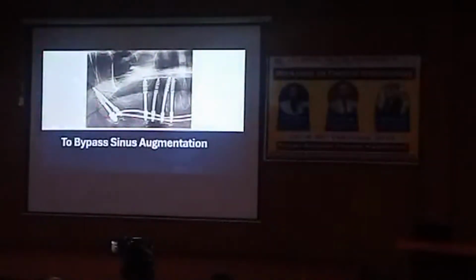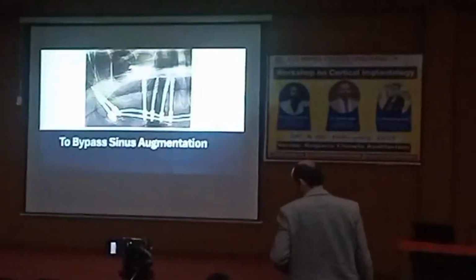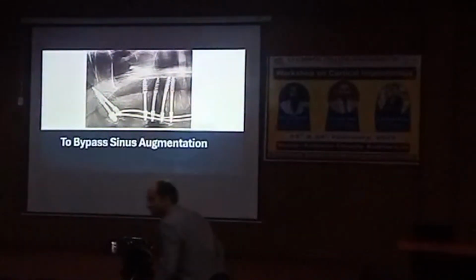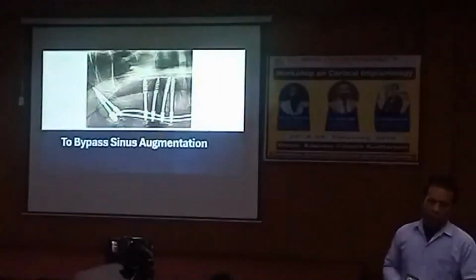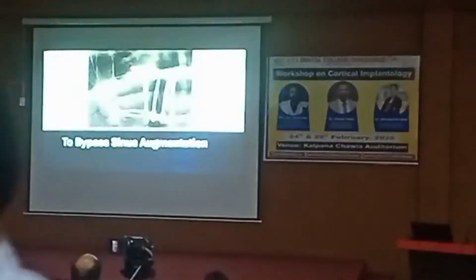If you can engage pterygoids and put implants, as sir told, in the A region, you are bypassing the surgical skill here. You don't need to do a further surgery over here. You don't need any bypass or graft surgery in the sinus region. So yes, we need pterygoid implants to replace the distal cantilevers and to bypass the sinus augmentation.